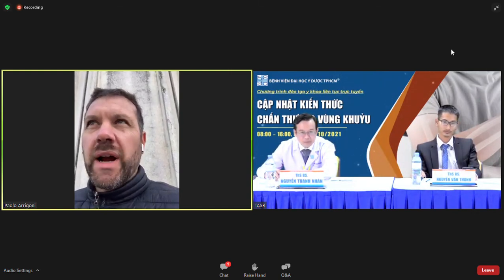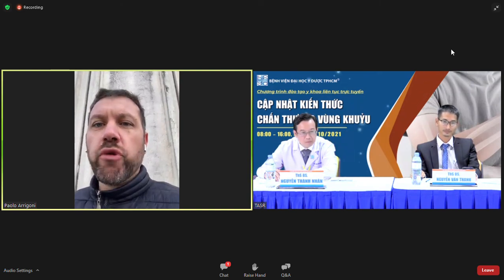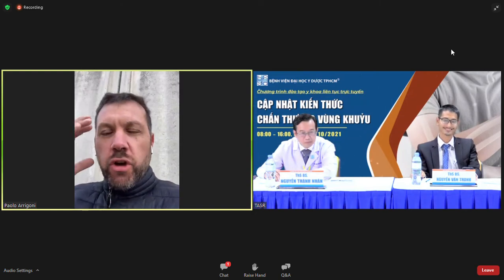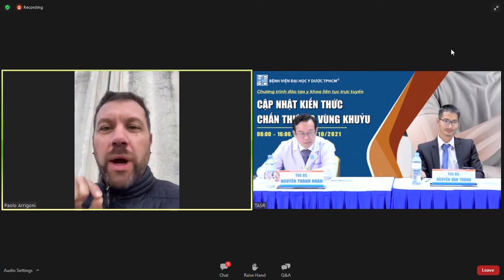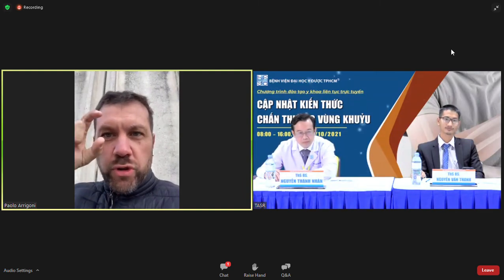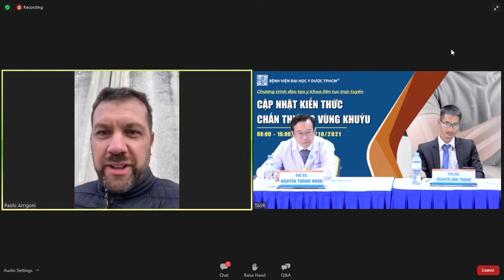Two is to try your pieces to find out if you have at least one piece with a full radius. You don't need the diameter, you need the radius. If in one of the pieces you have the distance from the center to the lateral component, that's all you need for measuring.